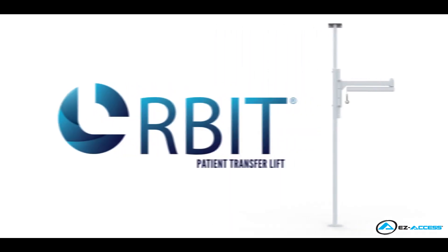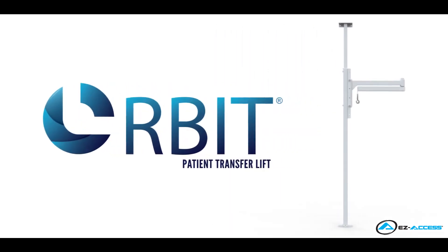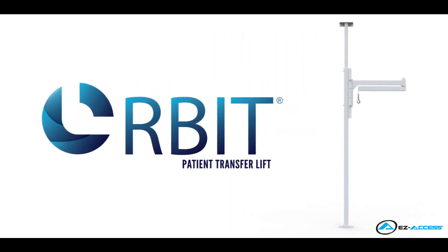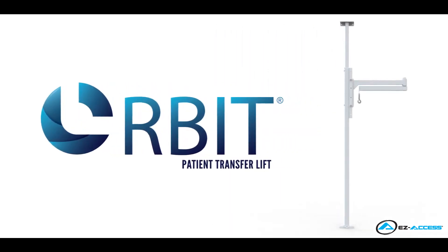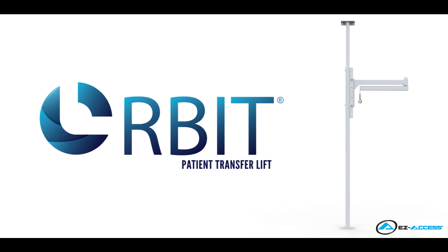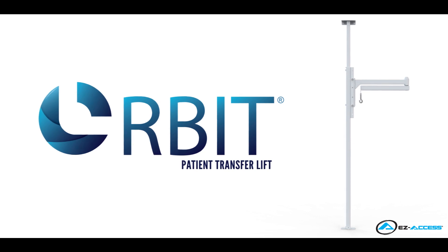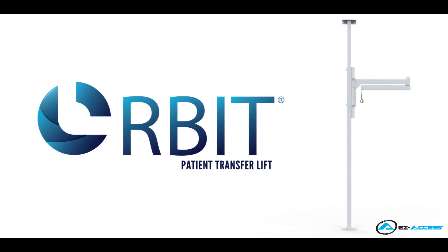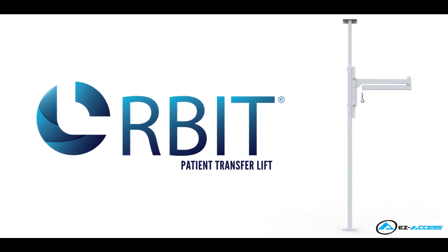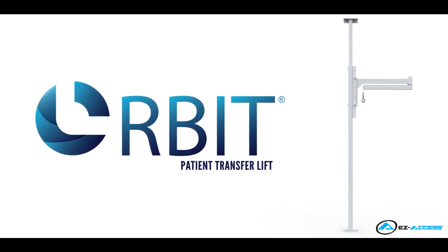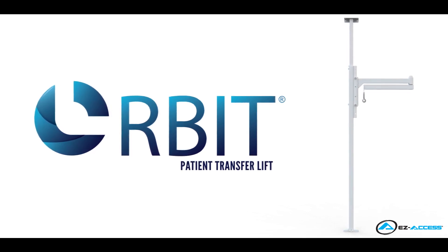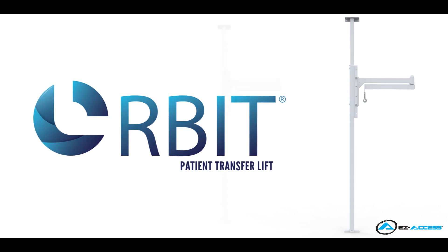Easy Access Orbit Patient Transfer Lift is an American-made, safe, and convenient device to assist in the lifting and transferring of individuals with limited mobility.